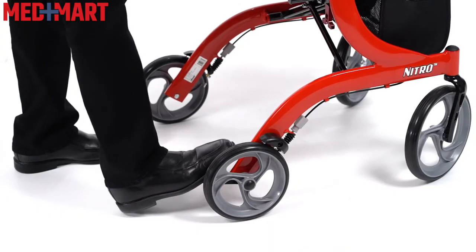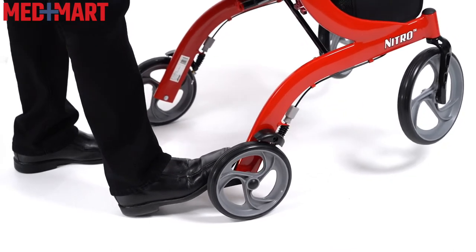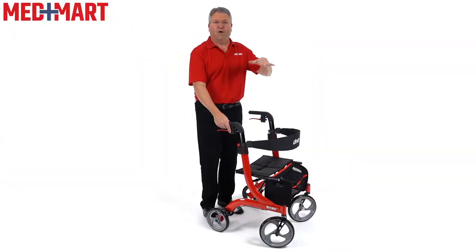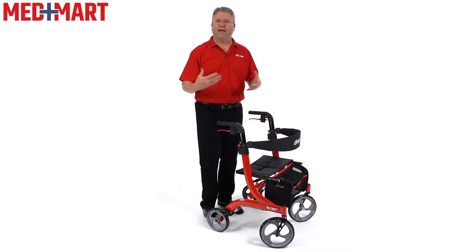Combined with a little footstep in the back, you can push down on that and it makes it easier to lift the front end of the rollator up for getting over small bumps, small curbs, things like that. So in combination, it's a very smooth rollator and it's easy to use.